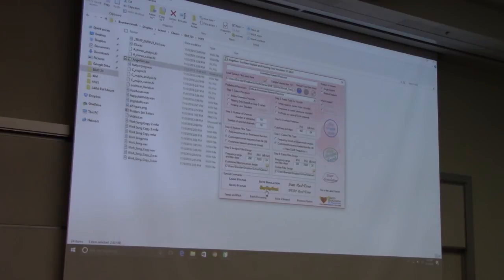And sure, they might have a favorite song they want to listen to with it. But you're going to have to answer the more complicated questions of how you can make this thing versatile enough that it can be used in everyday speech, but also used for music, and music also has different keys, different styles, different frequencies, some high, some low. If you wanted to look at the whole range of music someone might want to listen to, you might have on the order of 100 different notes, and that's probably unfeasible. So start to think about how you can take that sort of unfeasible goal and bring it into something a little more practical.